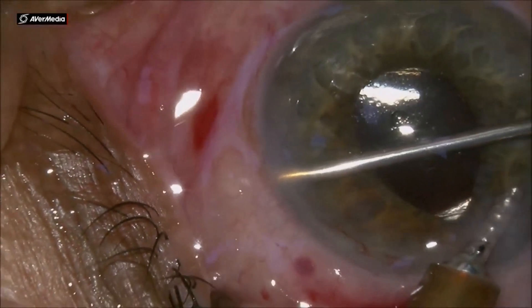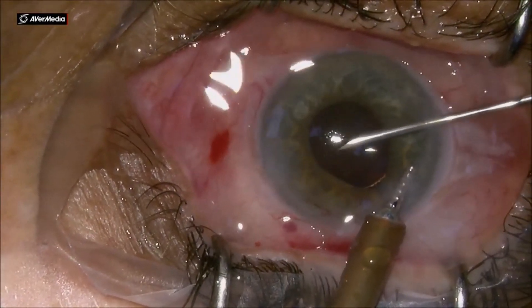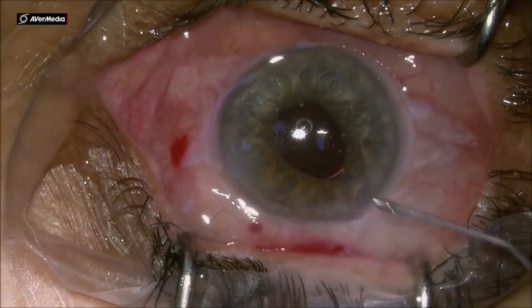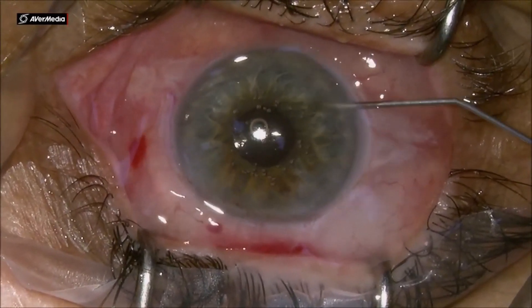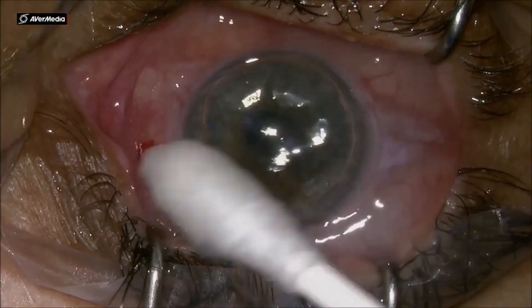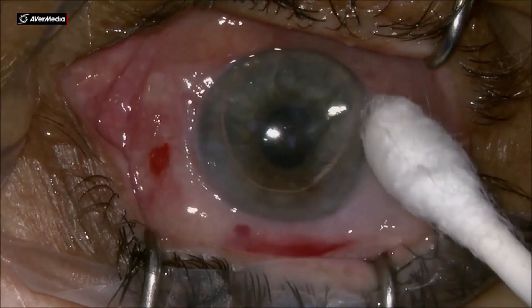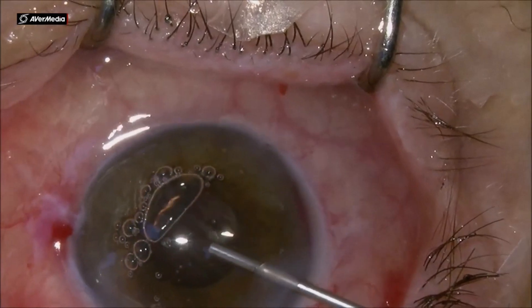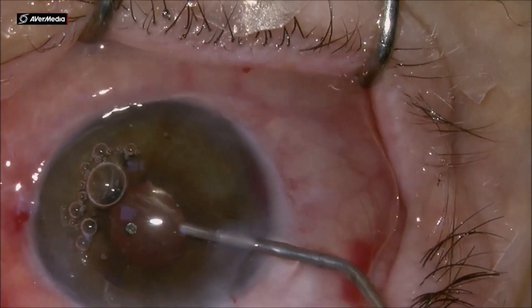In this second case, the needle is going above the sub-tenon space. The last case again is done under viscoelastic, again after cataract surgery, from the lower temporal quadrant. It is going across and into the sub-conjunctival space. In this case we will form a bleb.